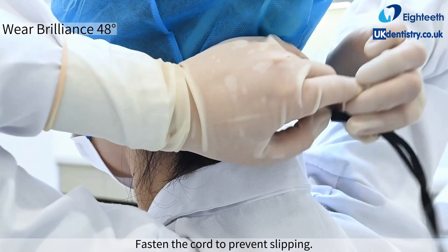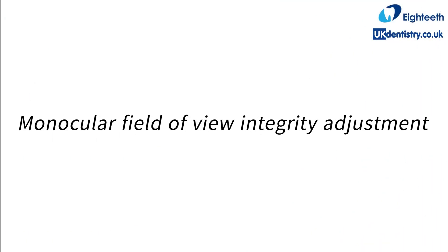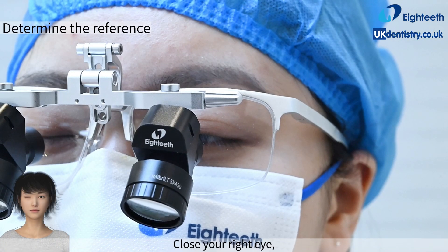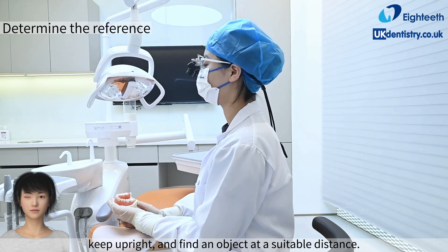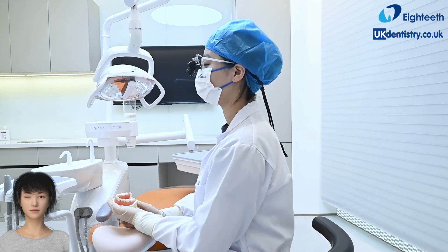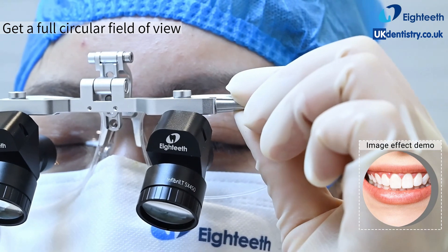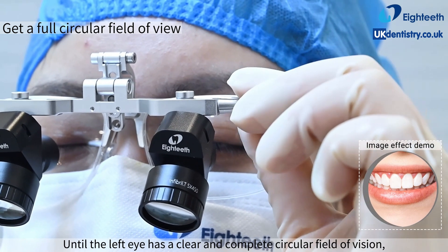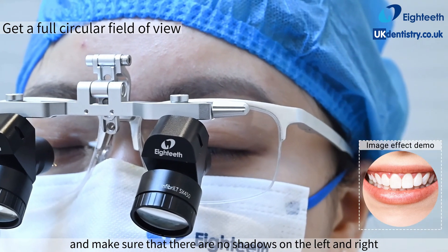Fasten the cord to prevent slipping. Close your right eye, keep upright, and find an object at a suitable distance. Move your head to an appropriate distance to see objects clearly. Rotate the left PD adjustment knob to adjust the left PD until the left eye has a clear and complete circular field of vision, making sure that there are no shadows on the left and right.